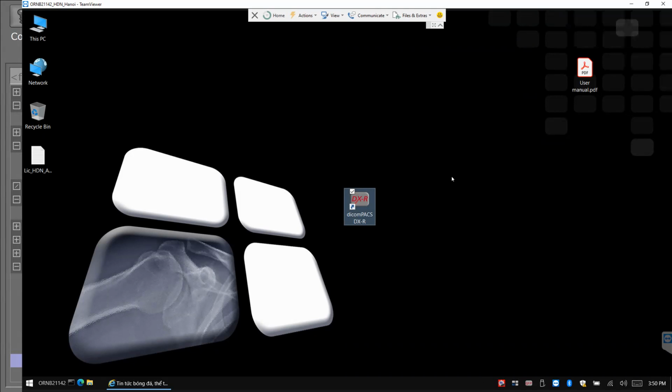Yeah, normally everything is preset in our software. When you start the software, it will check every component, and if there's something wrong with a component, it will give you an error message. For example, if you're working a lot and the tube is getting warm or hot, the generator will give the information to our software, and our software will give you a warning like generator is too hot, there is an interlock, you have to wait some minutes, and then you can continue. Okay.